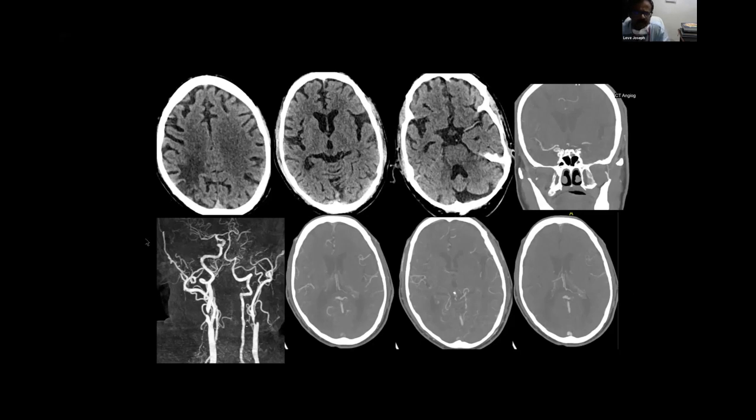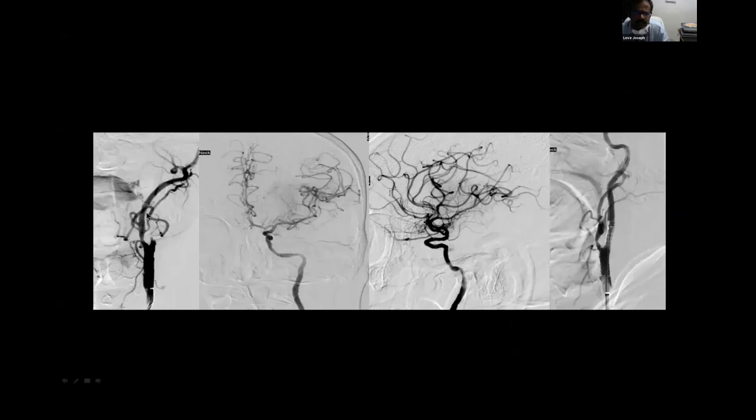So that's what happened. We did, the ICA is occluded. That is, you can see, imagine a plaque rupture here, plaque dissection as a cause of it. We generally cross this lesion, go to the intracranial side, and open the intracranial circulation first. Then, while coming back, we have opened the stent and treated the tandem lesion lower down also.